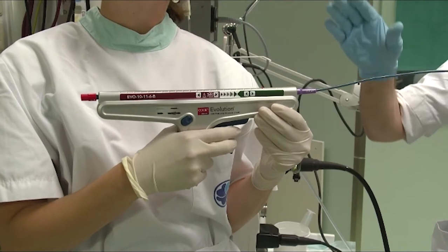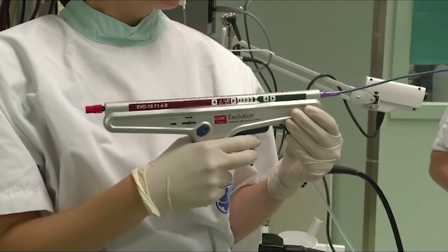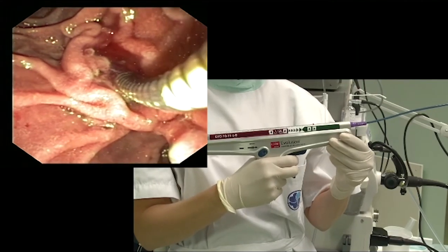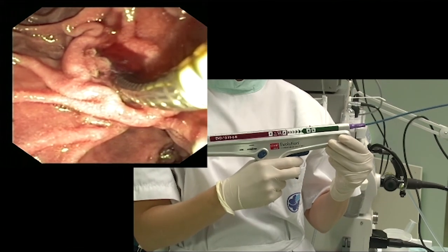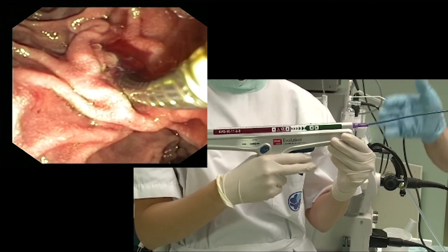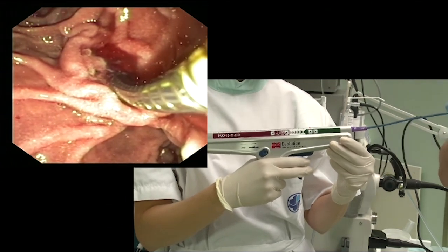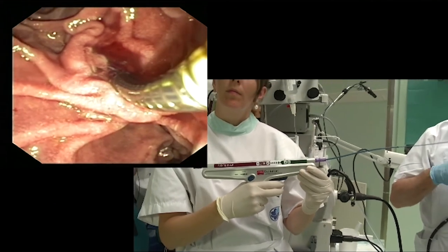And now, controlled both under endoscopic view but also under fluoroscopic view, we'll start deploying the stent. The stent will foreshorten about 30%, so I have to correct while deploying the stent by withdrawing the introduction system. Stop for a moment. You can nicely see that this is in a very controlled fashion. The nurse is deploying the stent now. I'm slowly withdrawing the catheter, and we will see the stent starting to deploy at the proximal end shortly.